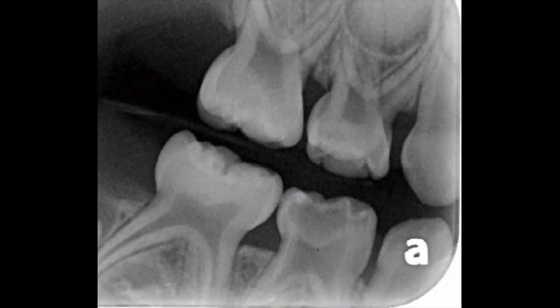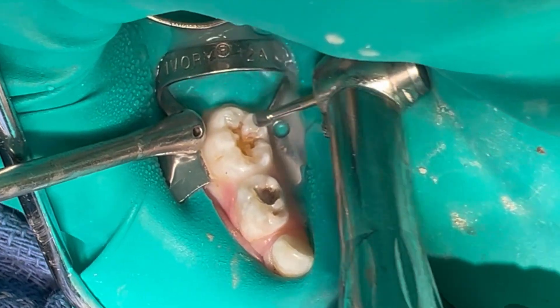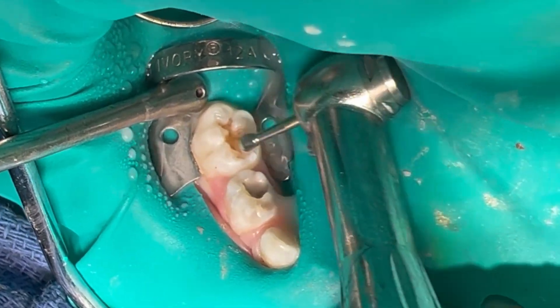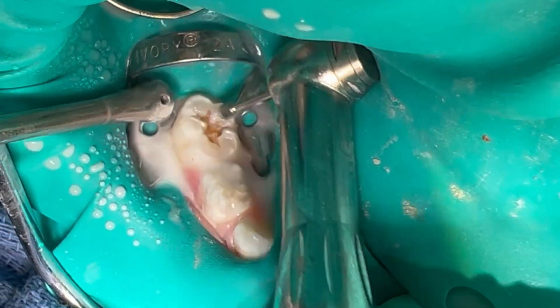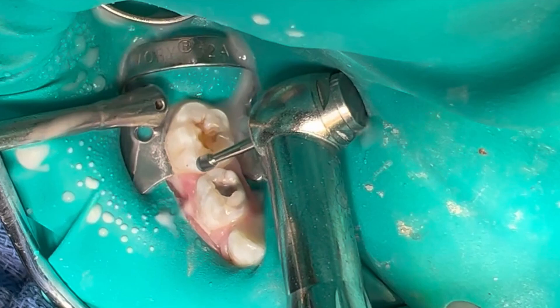This review is going to assess a BioFlex crown on T as in Thomas and S as in Sierra, reviewing the directions for use to seat these crowns successfully. When I first started placing the BioFlex crowns, I initially prepared a standard stainless steel crown preparation and fit stainless steel crown sizes, as seen in the following video.